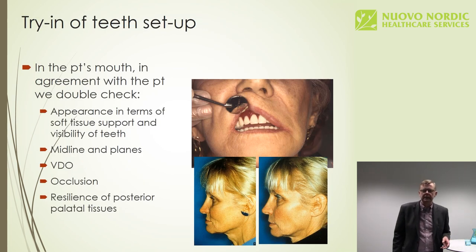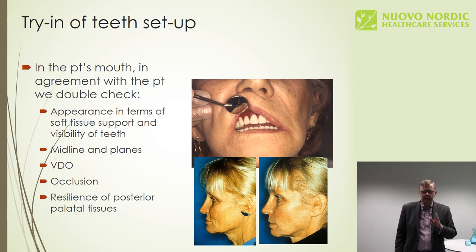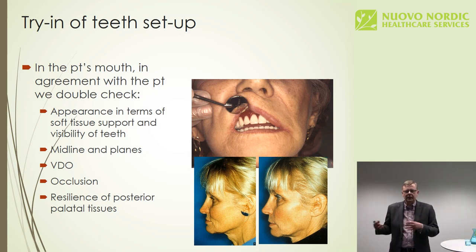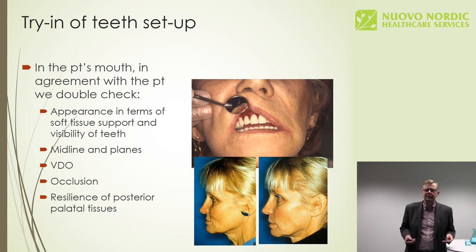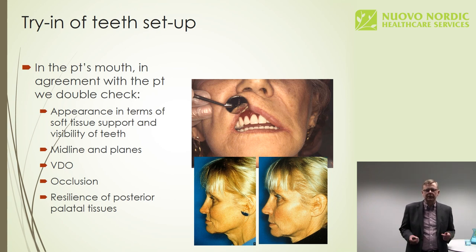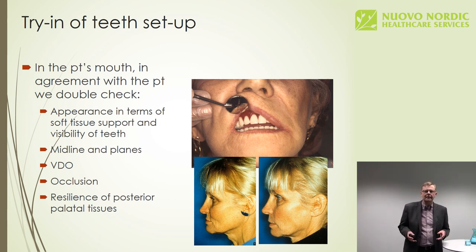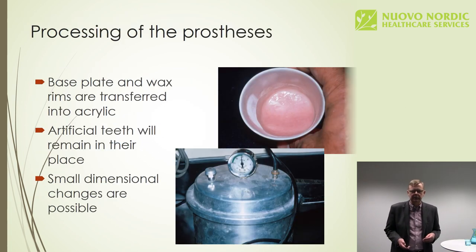So, once the technician has set up the teeth, we will verify the results in the patient's mouth. We will also, of course, monitor the midline, the planes, the visibility. We'll talk with the patient. We'll get his agreement. He or she will, of course, like to show the teeth to the neighbors and family members, etc. But quite often it's not possible to let the patient go with the teeth set up in wax. So anyway, once we got the acceptance of the patient and the occlusion looks good as well, we'll be ready to process the dentures.